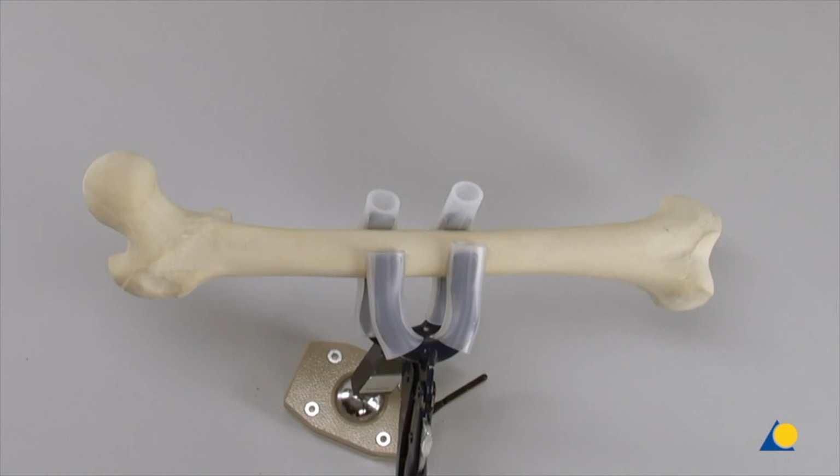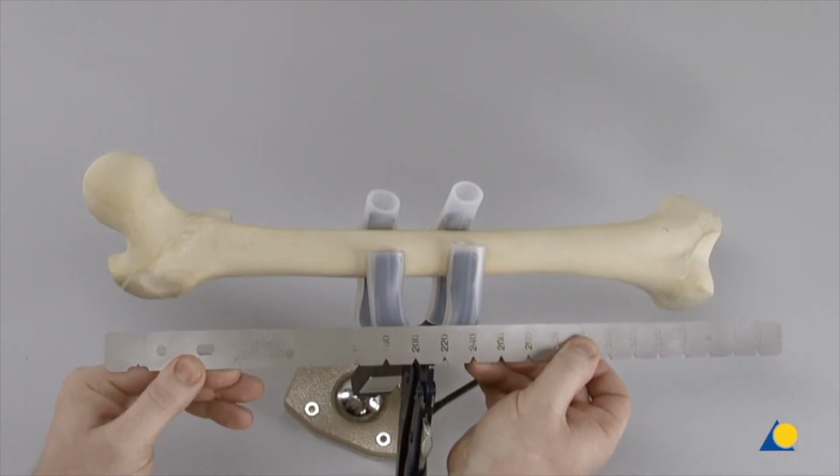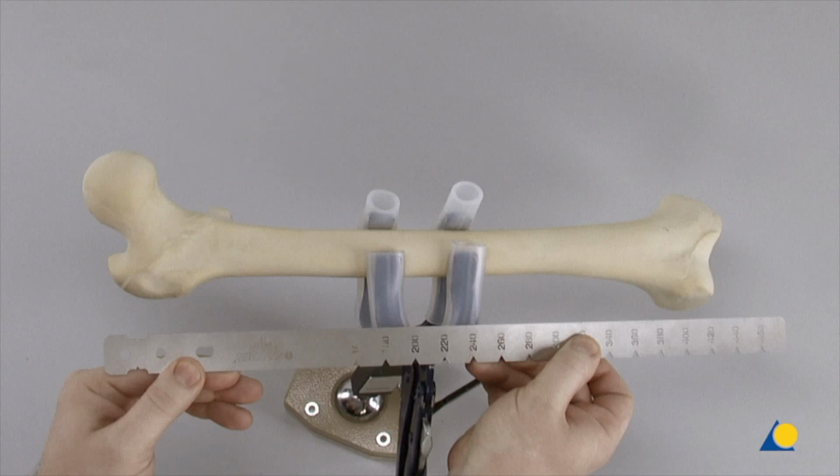365 millimeters. In the clinical situation, the image intensifier is positioned for an AP view of the proximal femur, and the long forceps is used to manipulate the radiographic ruler for nail lengths. The ruler is held parallel to the femur on the lateral side and at the level of the femur. The ruler is positioned with the end at or just below the level of the tip of the greater trochanter, and the skin is marked on the lateral side.